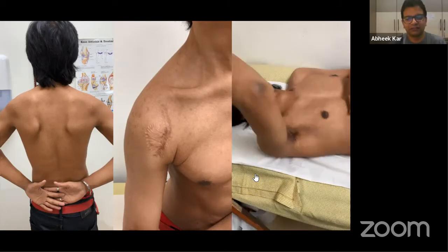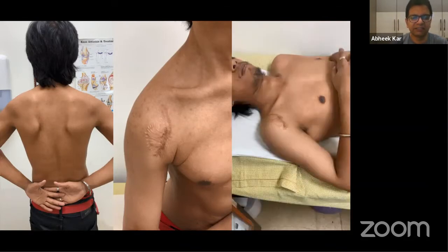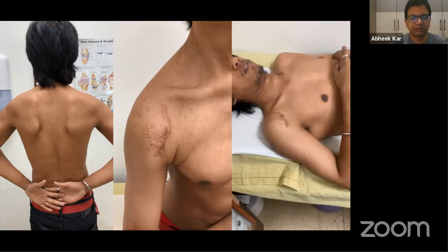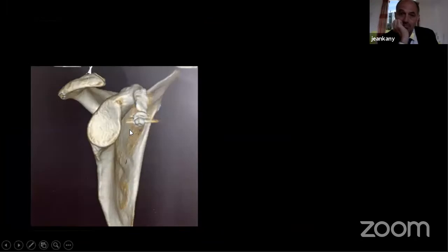And it goes back. So I decided to do an MRI and a CT scan. The MRI doctor was not sure whether he'd be able to do the MRI. He was not sure about the material quality or the artifacts. So they abandoned the MRI, and I'm just going to share one picture of the CT scan. There's no bone loss there. This is the washer, and this is the screw. I'm sure that this piece of bone has resolved there.